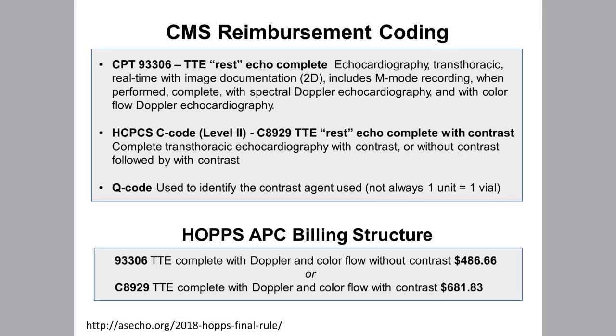Yes, here's the deal with non-compaction. There are a lot of cardiomyopathies, burnt out hypertensive cardiomyopathies, and certain forms of muscular dystrophies, where you can have prominent trabeculation, especially at the typical areas we look for non-compaction, the apex and the apical lateral wall. The criteria for non-compaction require you to be able to measure the compacta and the non-compacta, and the ratio. There are different criteria. Some are during systole, some during diastole. The key thing is you have to be able to reproducibly measure where the compacta and non-compacta begin and end.